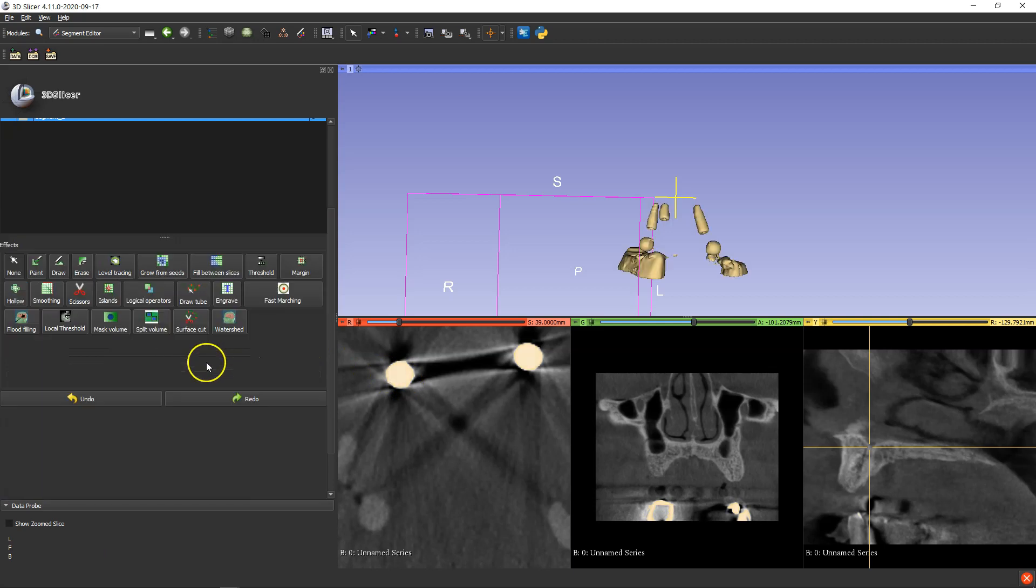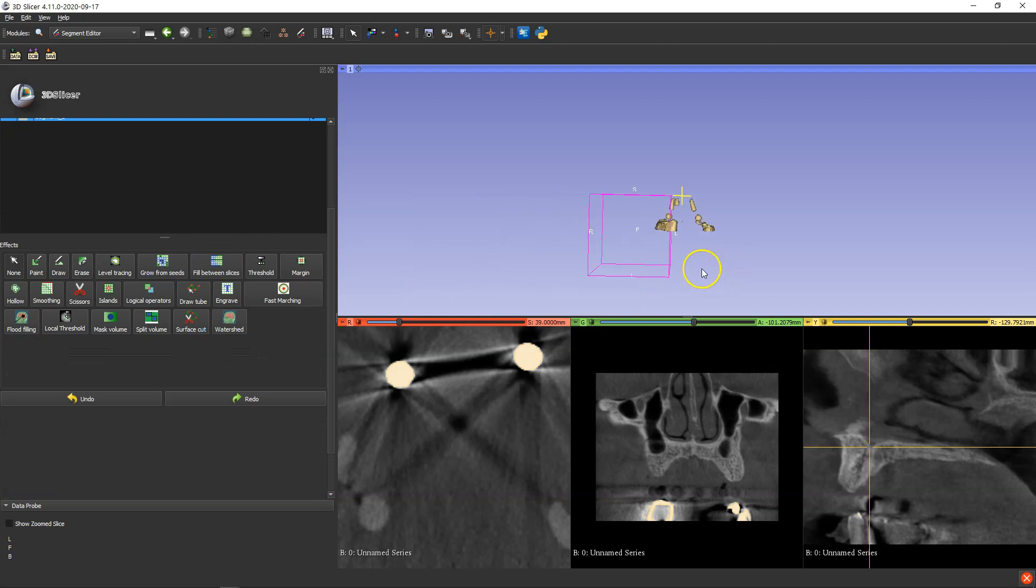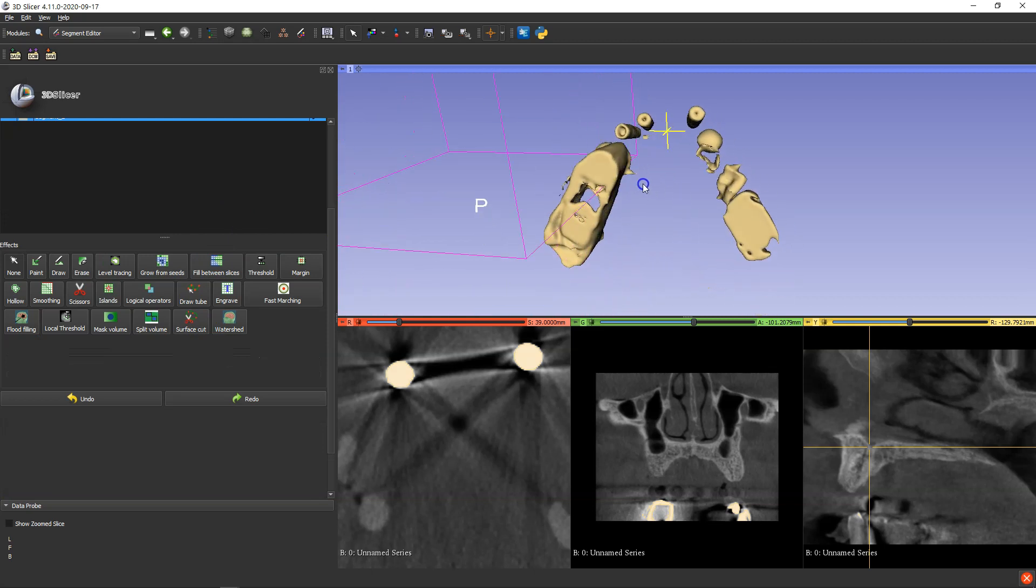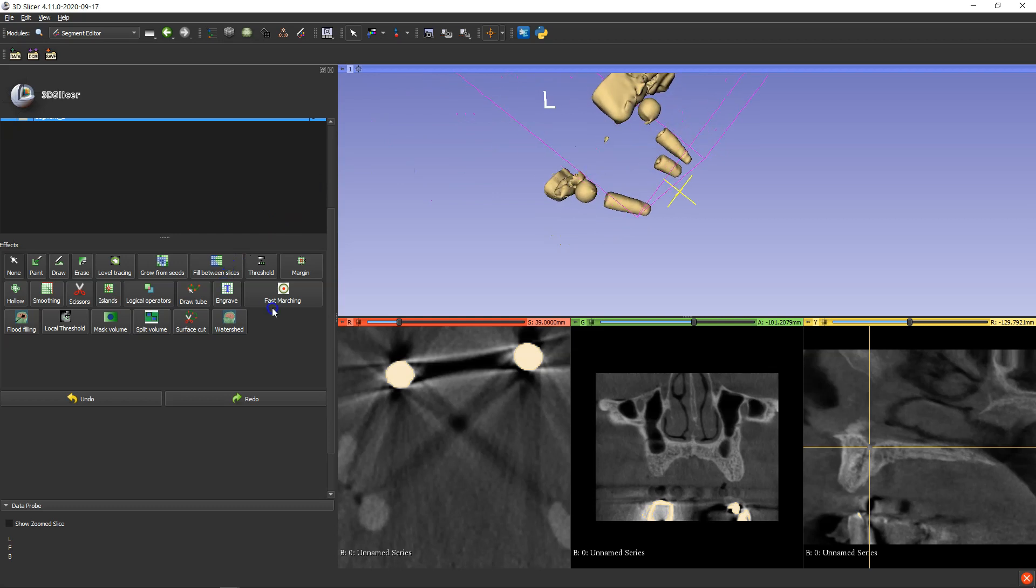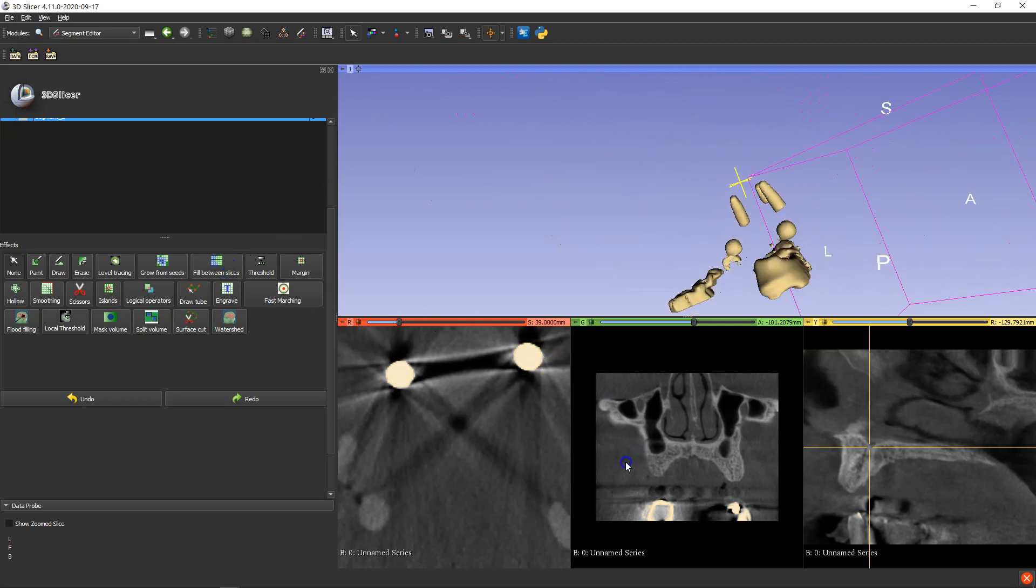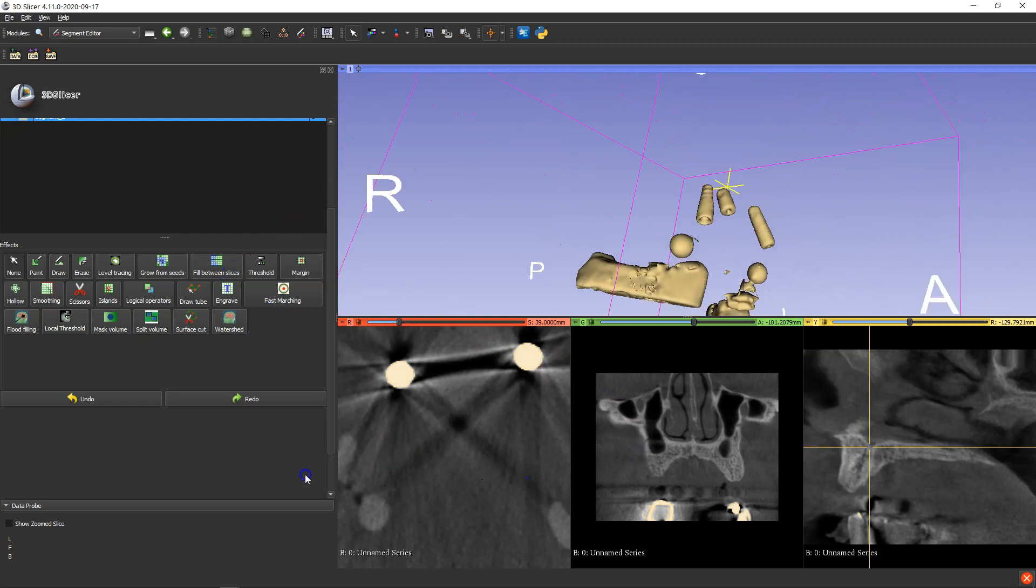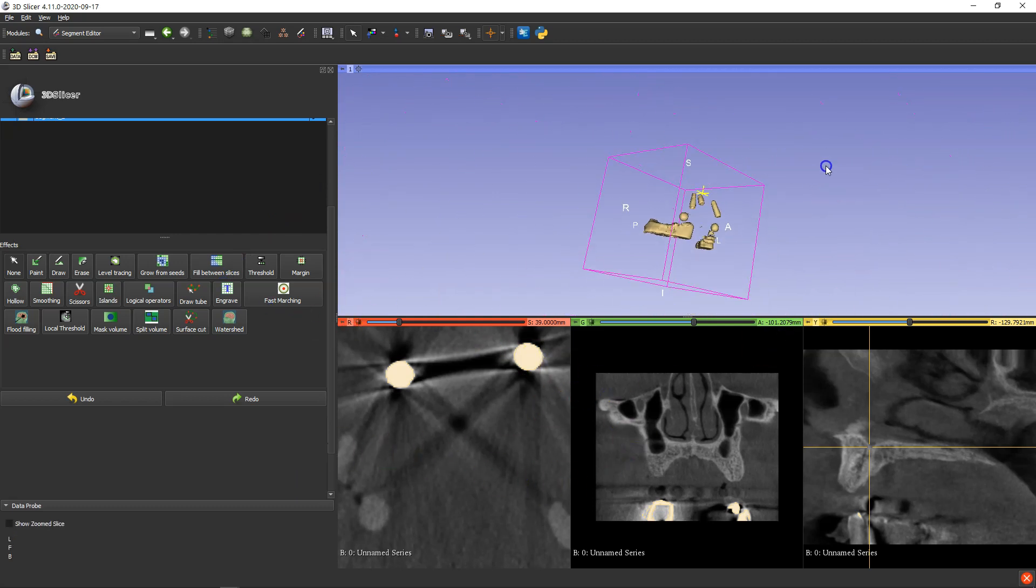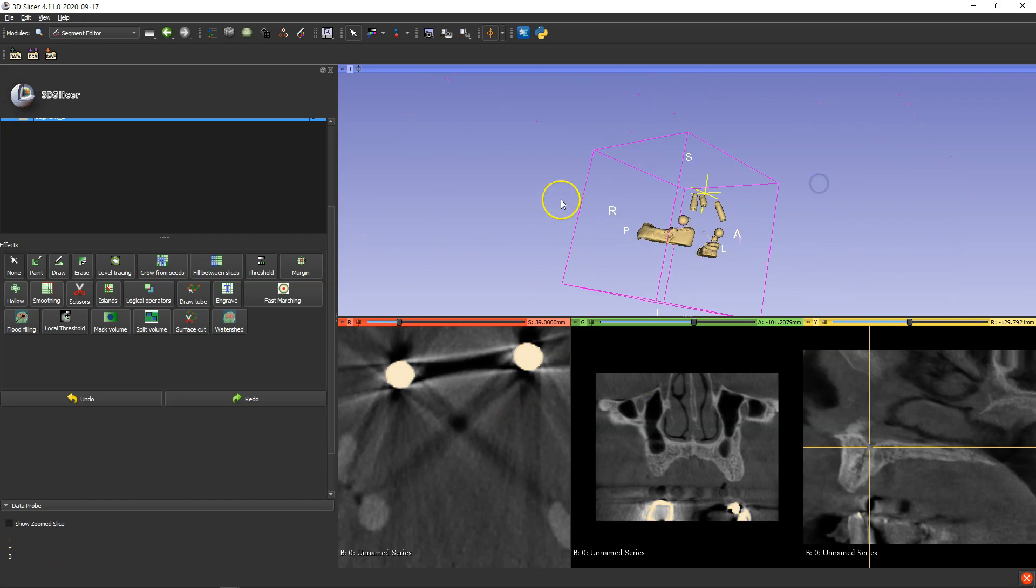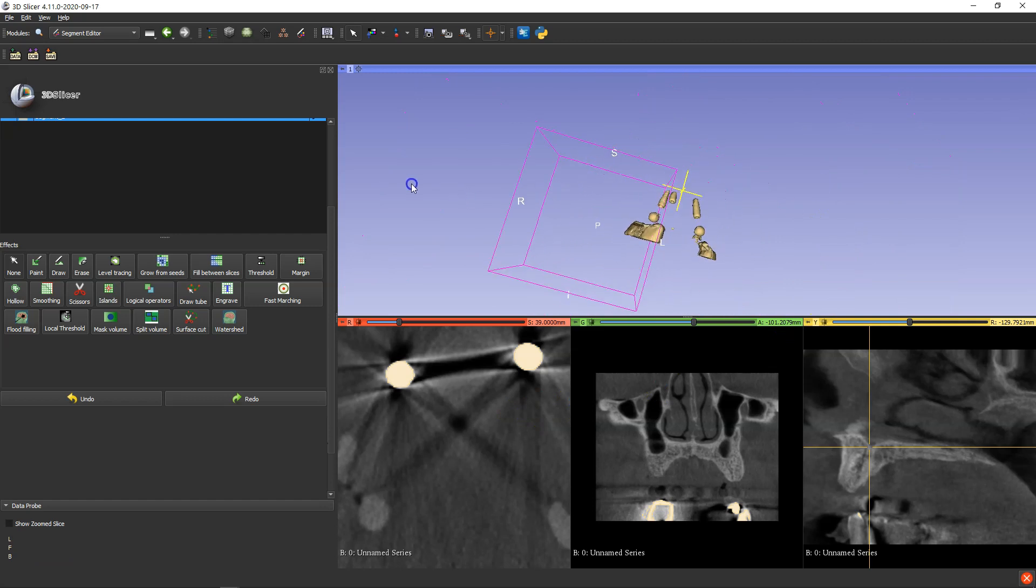And then what we're going to do is it brings it up, and it's even segmented my little implants which are already existent in the maxilla. This is really good.